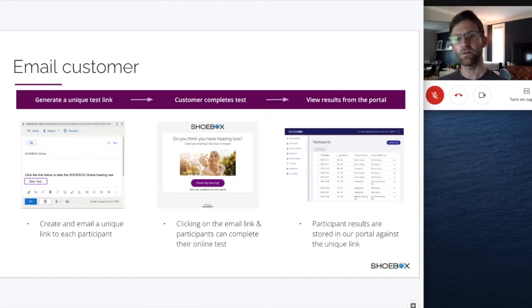And you can triage them at that point, so you can see out of the 10 people that contacted you this week, 3 of them had good hearing, the others had hearing loss. So you can triage them appropriately based on their hearing need. You can also do background questions with them, maybe a CEDRA questionnaire, and those kinds of things can really help you make the best decision to move that patient forward with extra knowledge.